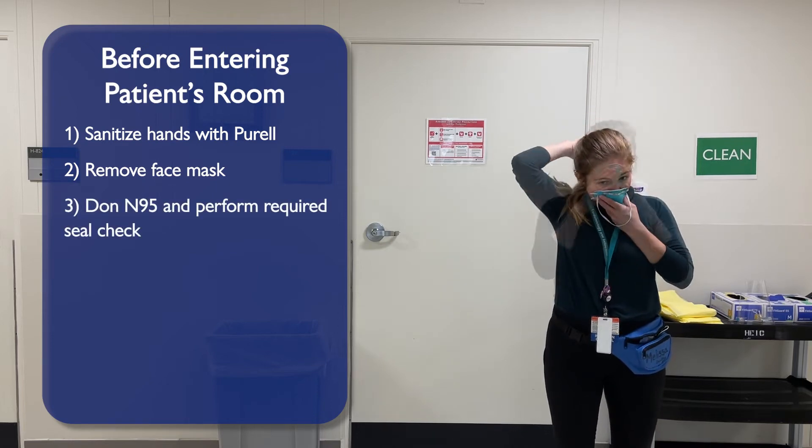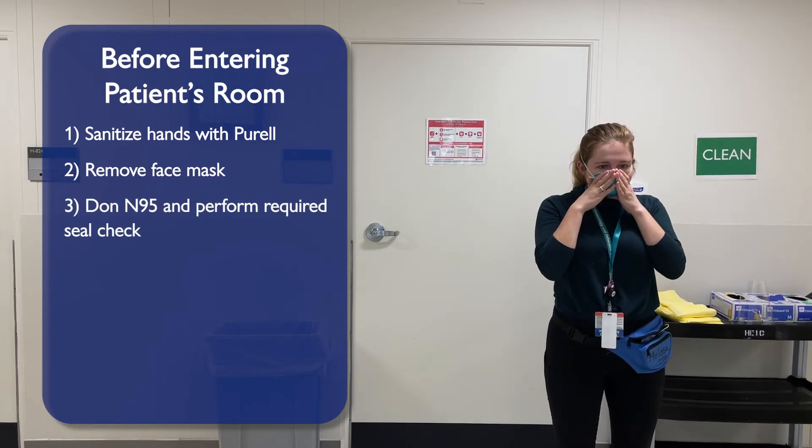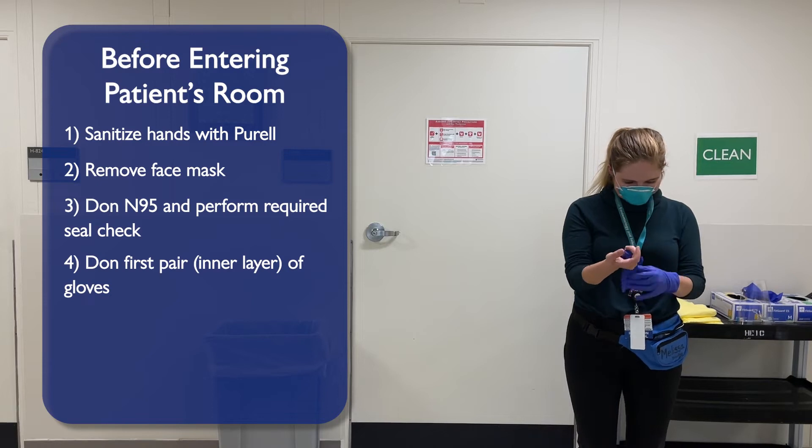Don N95 respirator and perform the required seal check. Don your first pair, inner layer of gloves.